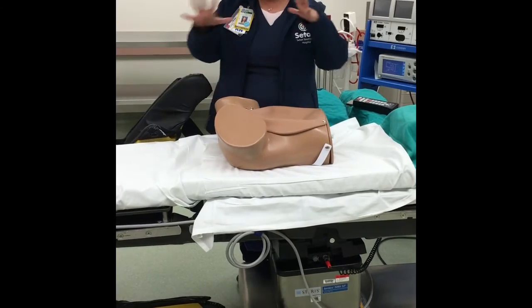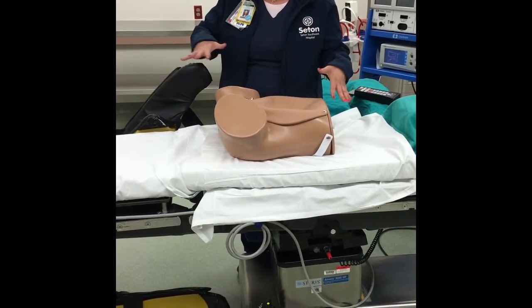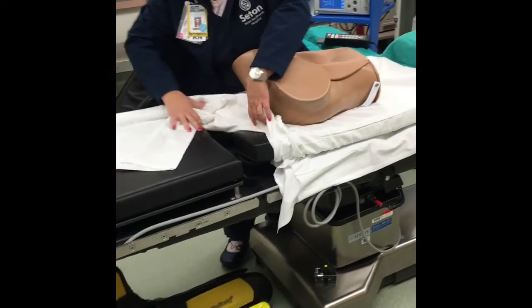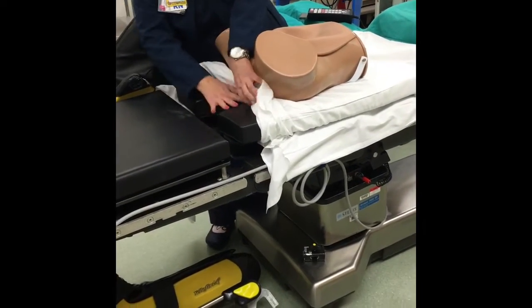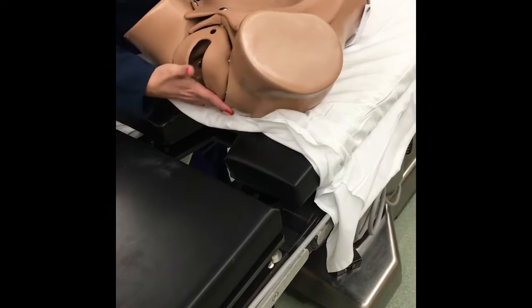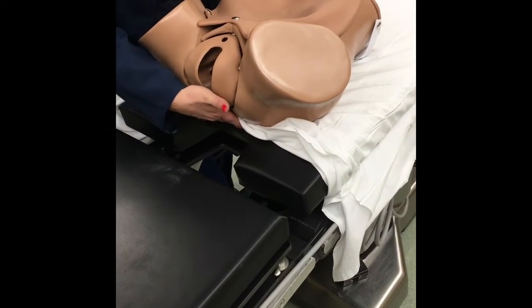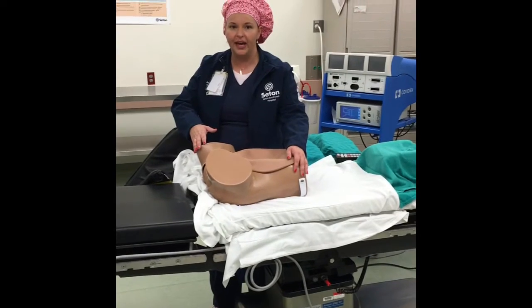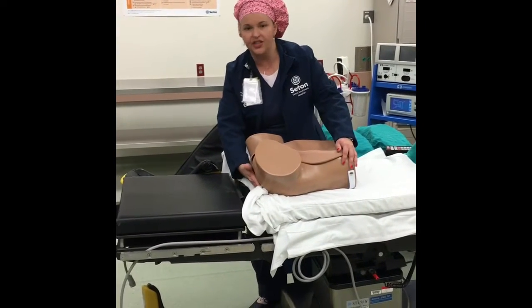So the important part about getting the patient to this part is making sure that you have the patient in the right positioning. So there's a little hole in this bed. You really want them to scoot down to where their bottom is sitting in the hole, and that way they'll be able to fit their legs in and be in a proper position. So we have the patient move over to the bed, and now they're in the right positions.